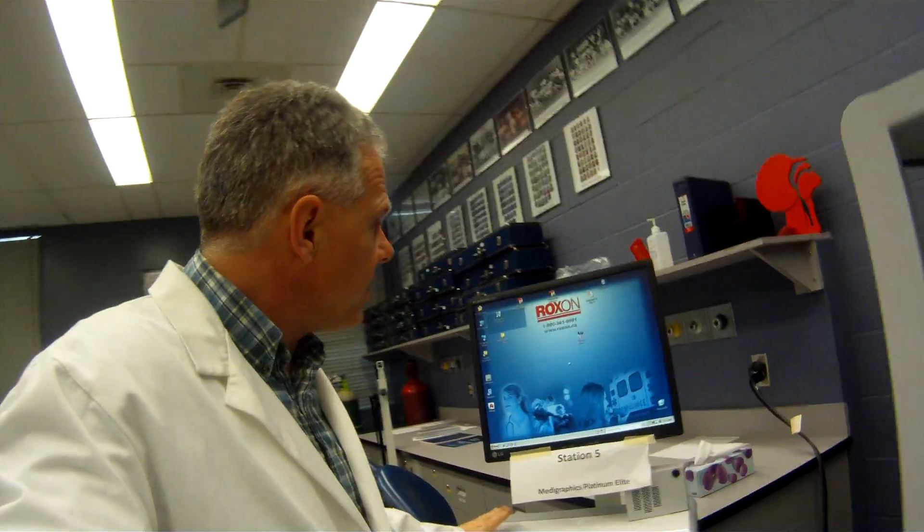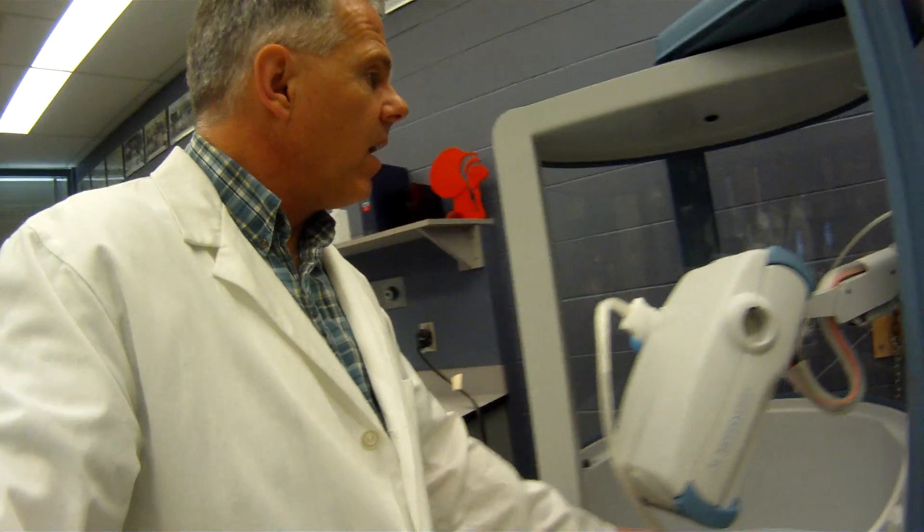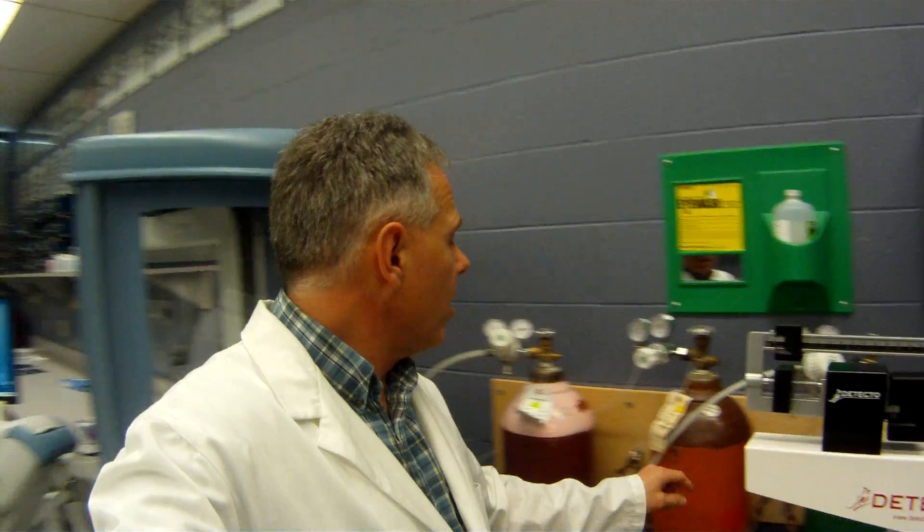The basic setup is we have a computer here, and all the required equipment is built right into the base of the unit. We've got our gas tanks here — we've got oxygen, helium, and our DLCO mixture. So we can do all the basic tests, such as nitrogen washout, DLCO, basic spirometry, plethysmography, carbon monoxide uptake, and single breath nitrogen washout. We've got a wide variety of equipment here.